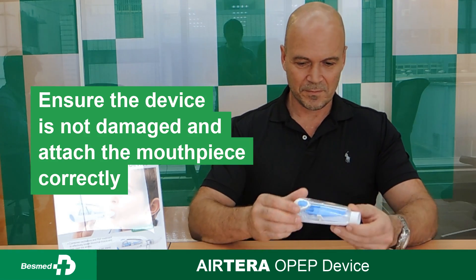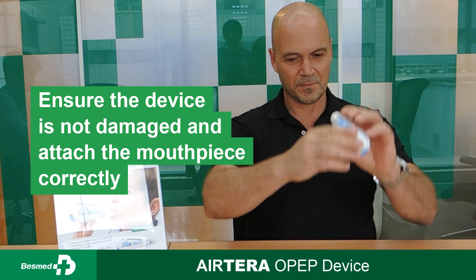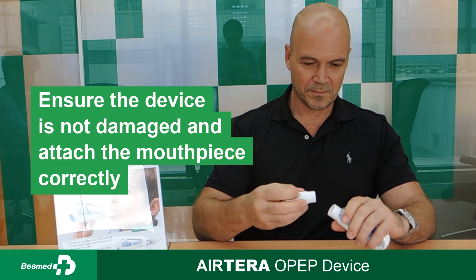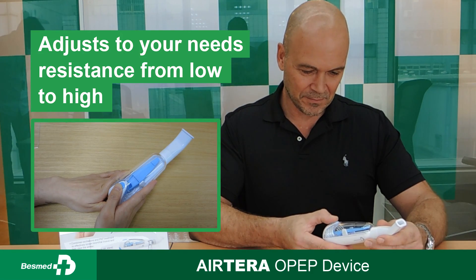Ensure all parts of the device are unbroken and assembled with the mouthpiece correctly. Determine the proper resistance setting.